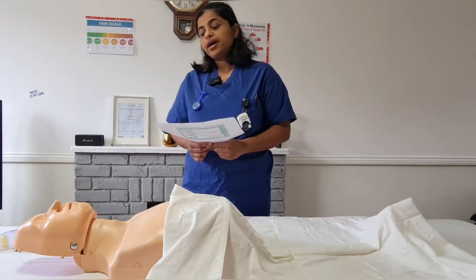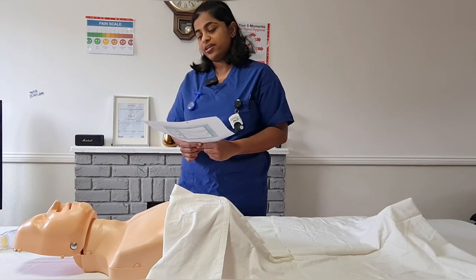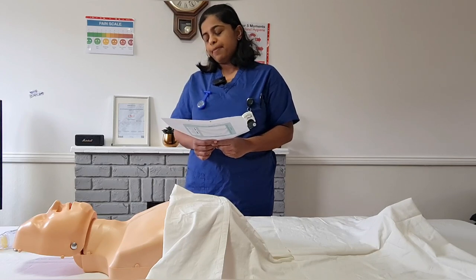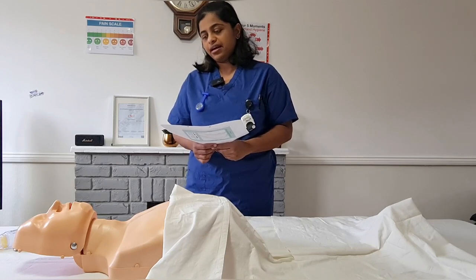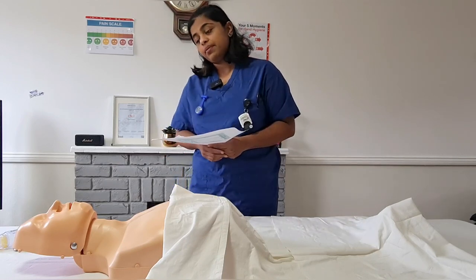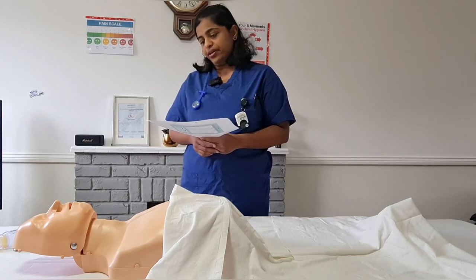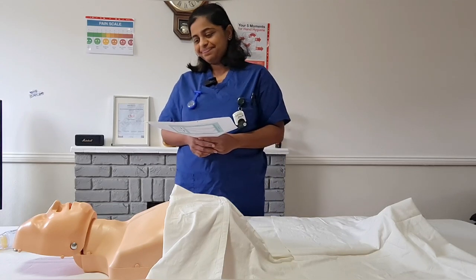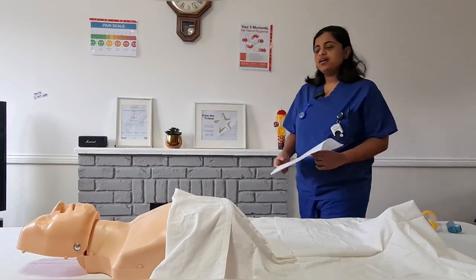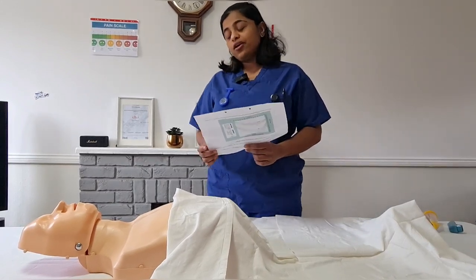What I'm going to do now is get your equipment ready and I will come back with your inhaler. Here is a call bell in the meantime; if you need anything you can let me know. Hi Emma, I'm back with all my equipment.